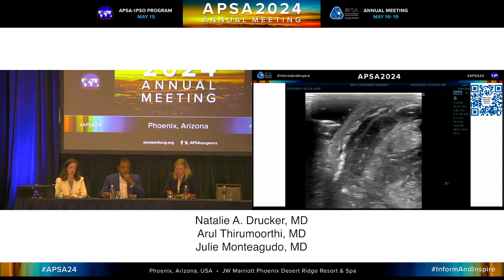Okay, so access. I absolutely believe that you need to pile a lot of gel on the space you're going into. And it's important not just for visualization, but because any pressure on these children will collapse the vessel. So you have to have your hand resting somewhere. Elbow on the table. These kids are too small to rest your hand on their chin, but you need to have your hand floating in the air, whatever it takes to stabilize it, whether you need to put a towel down or anything else, but you can't put any weight on it. So when I'm taking fellows through this, I won't let the probe touch the skin. And if I see any distortion, we stop and we reset.